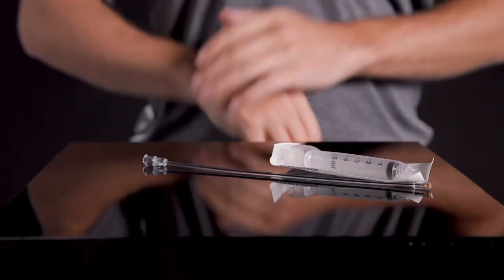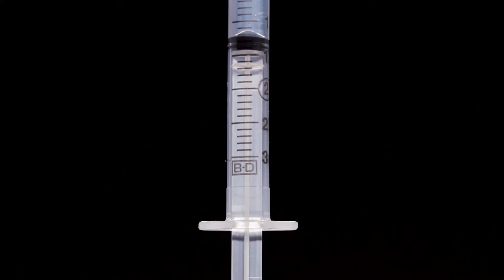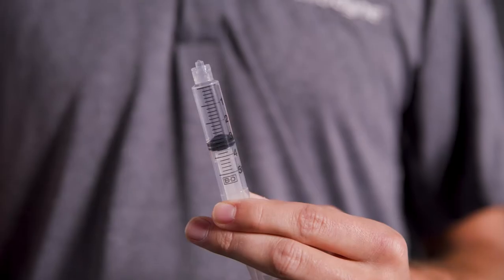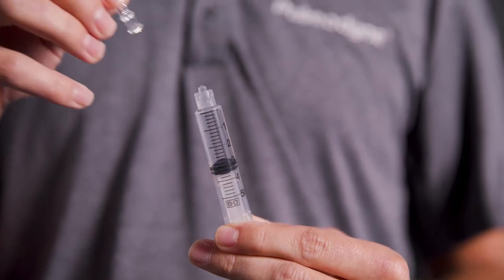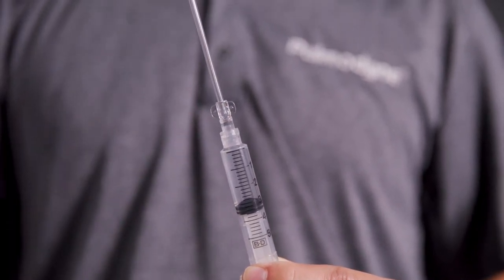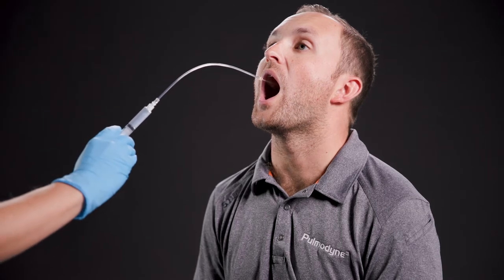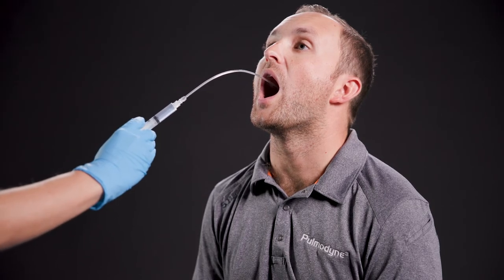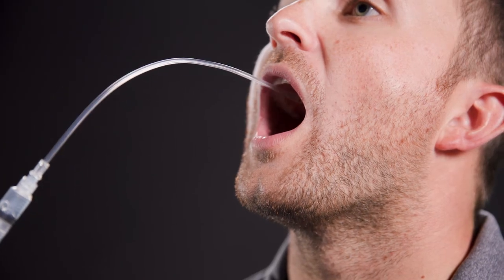Remove the DART Reach from the packaging and add the desired volume of anesthetic to the syringe. Reattach the DART Reach to the syringe by turning clockwise. Atomize a small volume of the topical anesthetic onto the mouth, tongue, and posterior oral cavity, allowing time for the anesthetic to work before proceeding to each additional step.